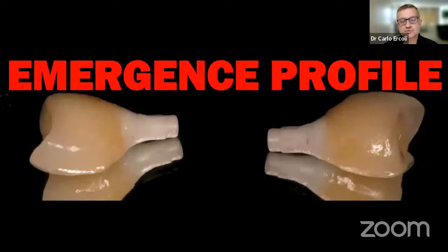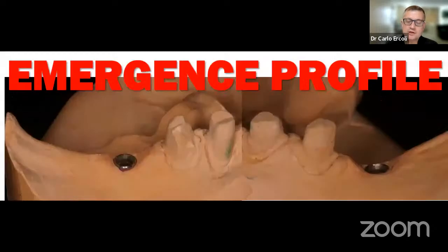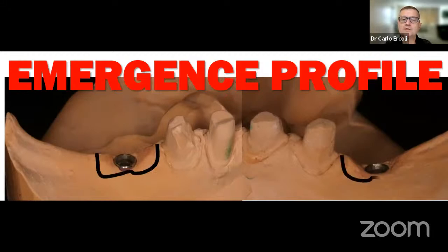The next phase, of course, is the emergence profile. As we said, it's not truly critical in a posterior restoration, but it is important for the establishment of the biologic width. Now here, let's have a little moment of pause. If we look at those two implants that are placed in the respectively 36 and 46 area, one might think that they are okay. But if one tries to project where the gingival margin of those molars will go, you realize immediately that those implants have been placed without due consideration for the placement of the crown.